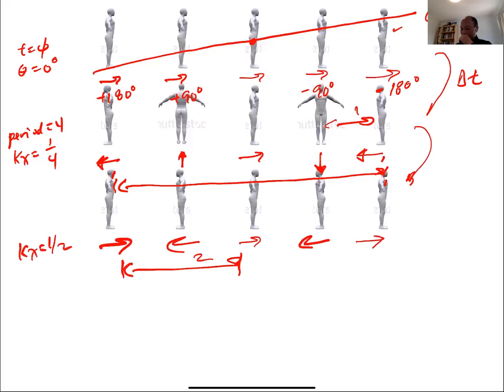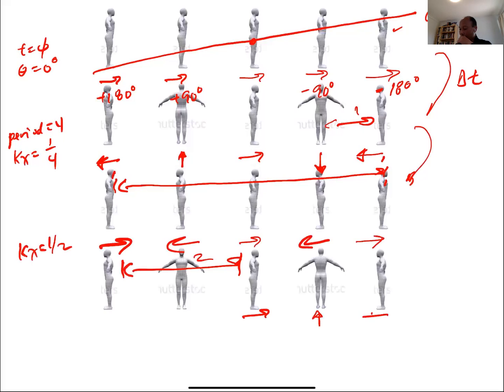You can go one more time step, and look at this spin at the isocenter, it's always staying the same, but now we have this guy pointing away from us. This one's pointing opposite to that one, this is pointing towards us, and this is pointing away from the spin at isocenter. So once again, we have a period of 4.